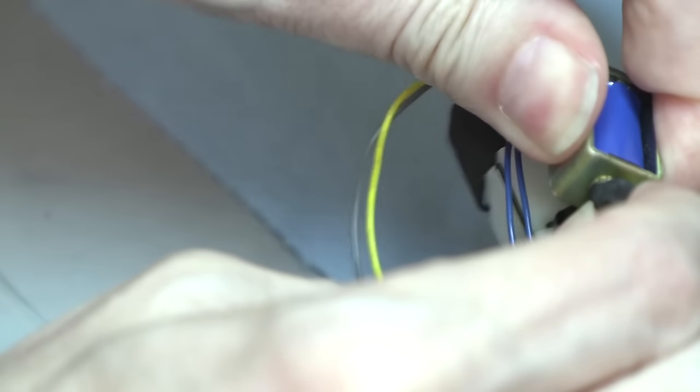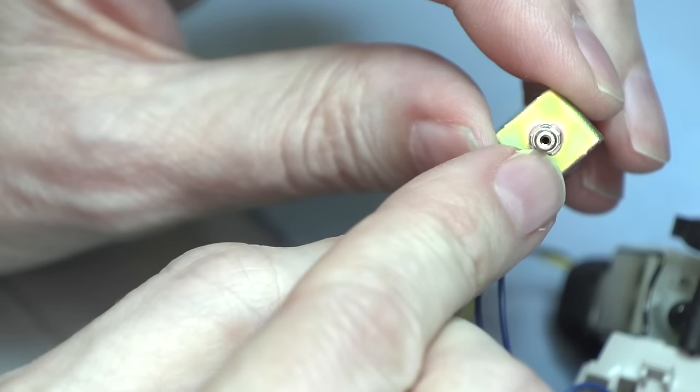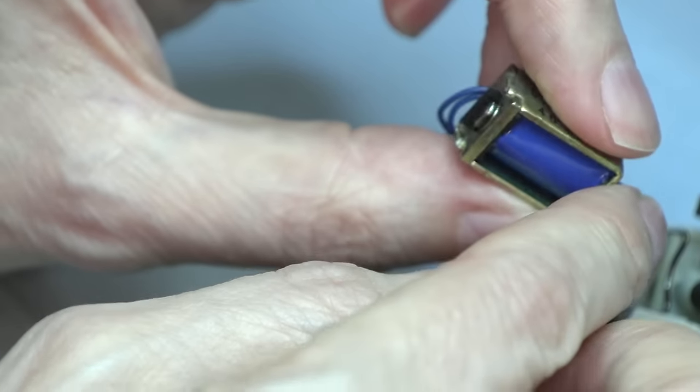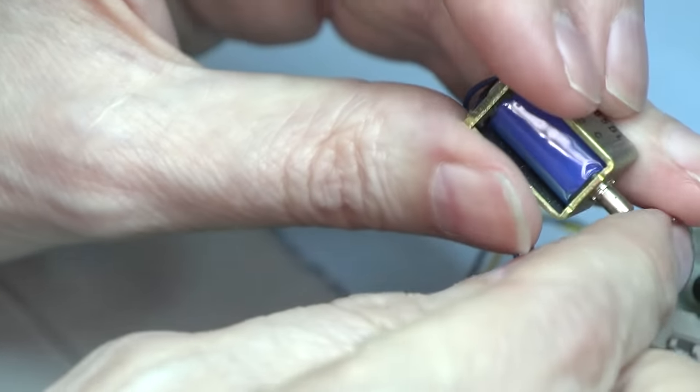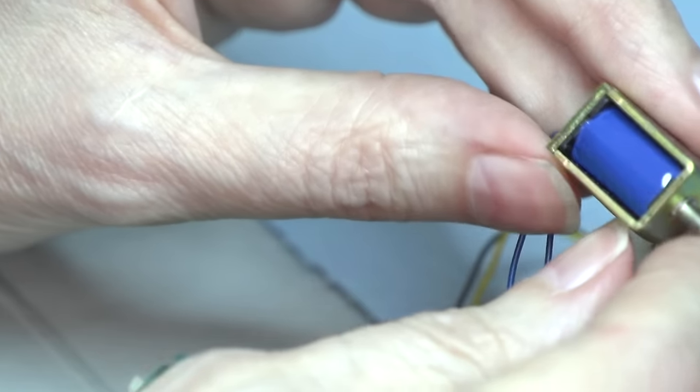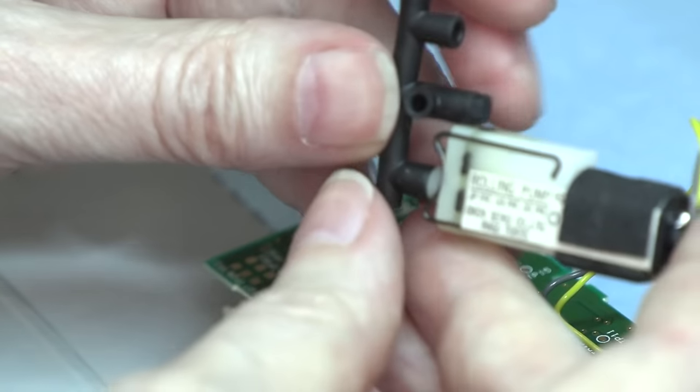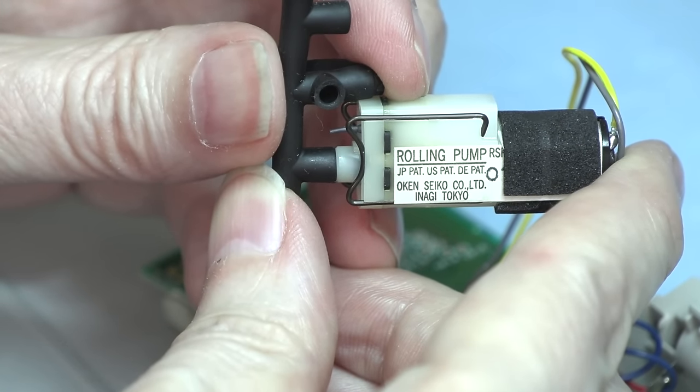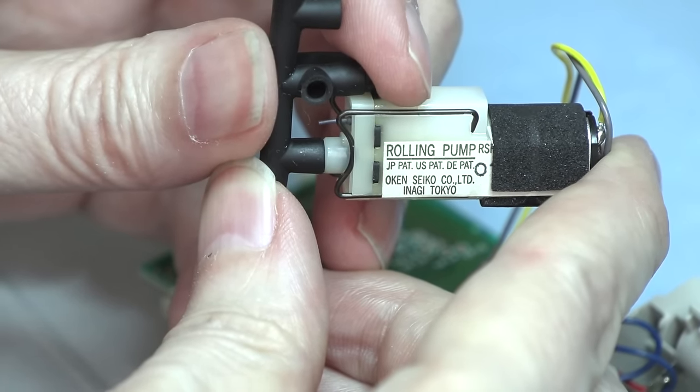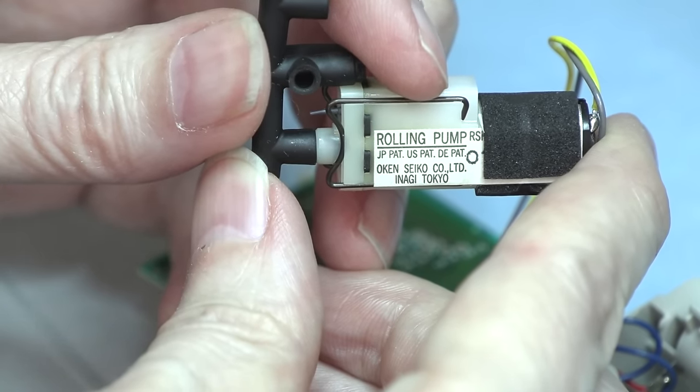A little nozzle there, so yeah, so that's all that is. It's just a valve. That's gotta be pretty handy for something, and this side we've got a rolling pump. Yeah, oh, Japanese patent, US patent, German patent, Okenseiko company Limited.